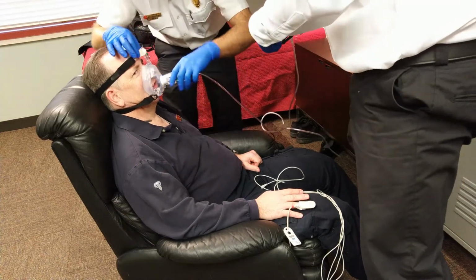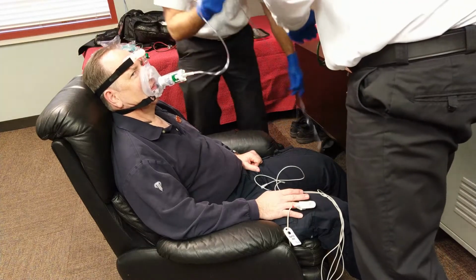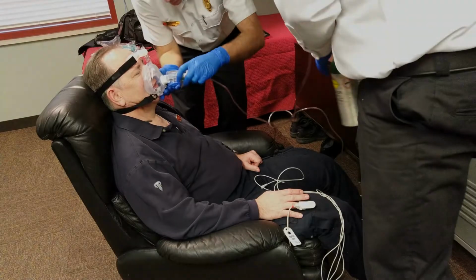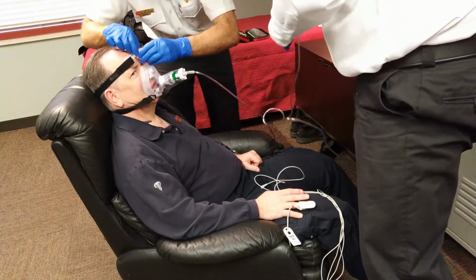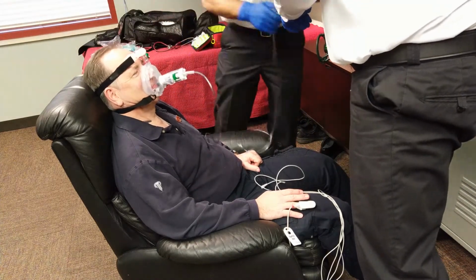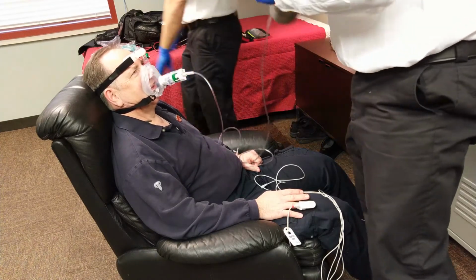And after the mask has been applied, then we're going to plug in the CPAP device, the actual hard plastic portion that delivers oxygen. He's got it right there in his hand. Give that a firm application and adjust the mask as necessary to get a good seal. Once you have it in place, attach it to the standard port on the oxygen bottle and set your flow rate to 10 liters a minute.